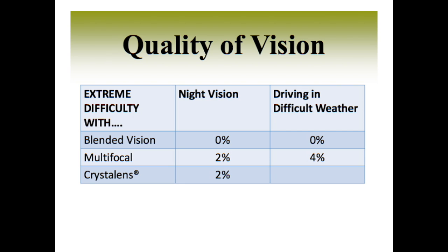And then you have driving in difficult weather. Look at that, 4% with the multifocal. With the crystal lens, what's been reviewed is the night vision, and that was 2%, very similar, extreme difficulty driving at night as to the multifocal. So you can see here, with 0 severe complaints with blended vision, that's why there's 100% satisfaction.